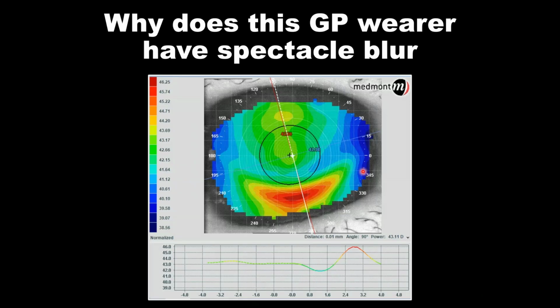Now, here's another case where we saw some changes over time due to our contact lens wear. And here's a patient that was wearing rigid lenses and had spectacle blur when they removed the contact lens.